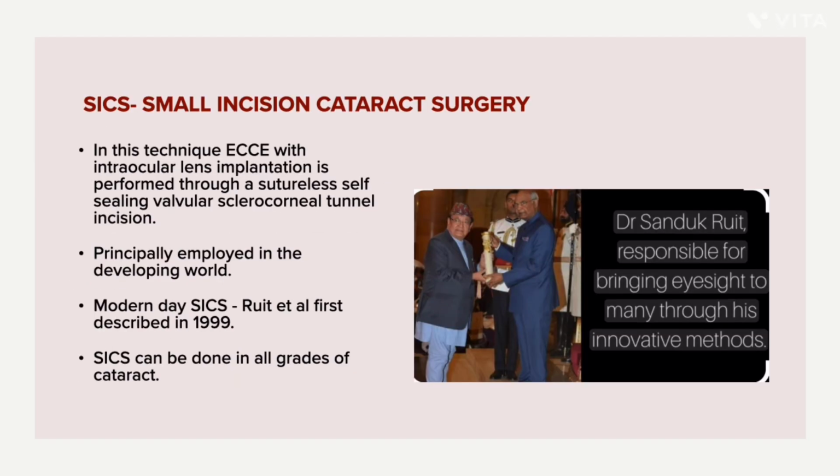Now moving on to small incision cataract surgery, which is a widely used technique, especially in resource limited settings. It is a method of extracapsular cataract extraction along with implantation of a PCIOL. The key feature here is that it is done through a self-sealing sclerocorneal tunnel incision, and this sutureless approach reduces the surgical time, promotes healing, and minimizes complications related to sutures. SICS is particularly important in developing countries where high patient volume and limited resources make cost-effective and efficient techniques essential.